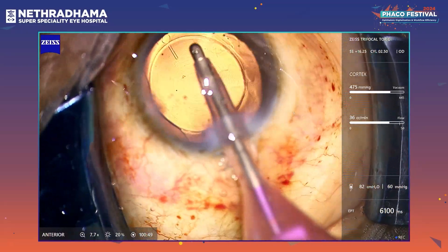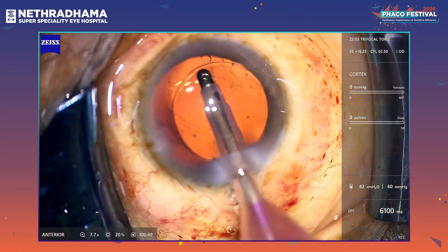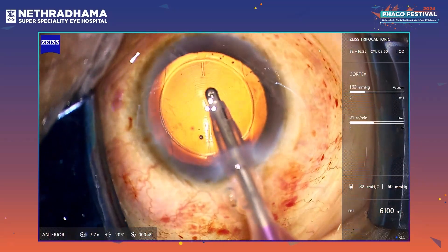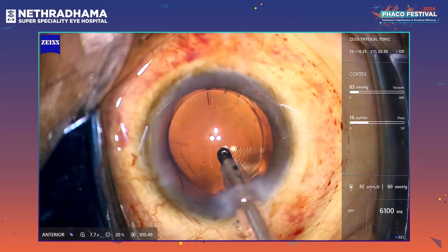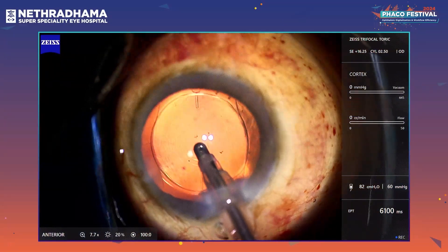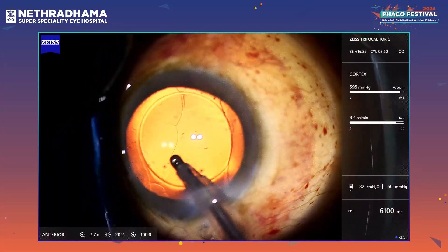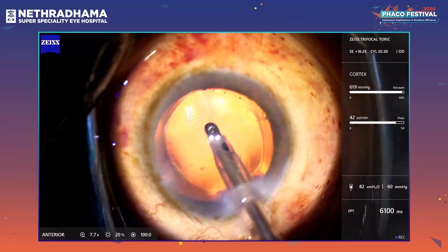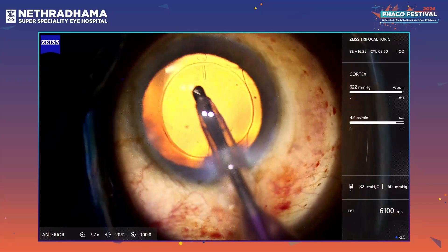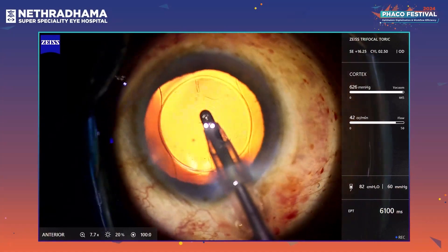It's a hydrophilic acrylic lens with 4 plate haptics. As I'm doing the IA itself, I can quickly and easily align the lens to the nubs. I'm going to switch to retro illumination so the nubs are seen more clearly. I'm doing a rock and roll technique to remove the visco from the bag. You can see that the lens is fairly well aligned and quite stable.